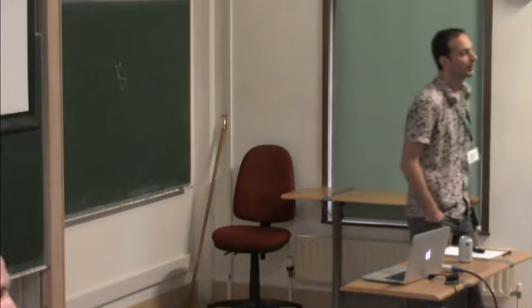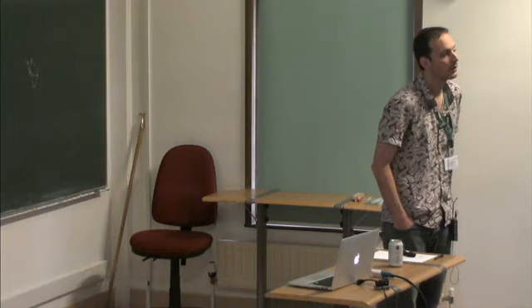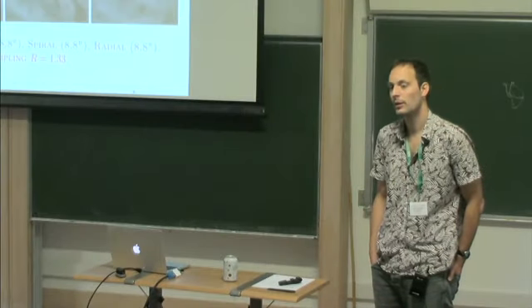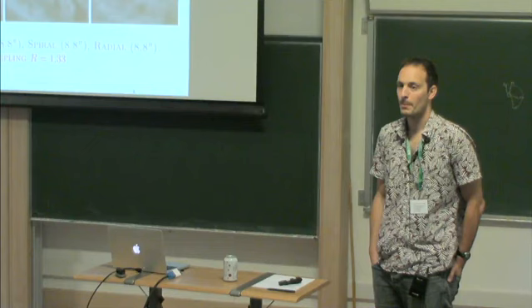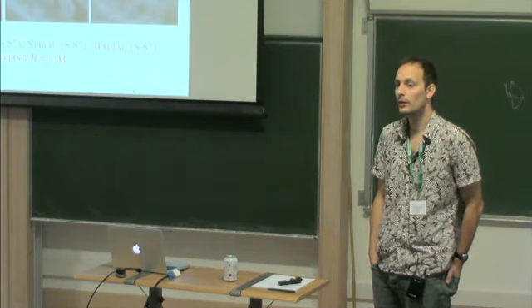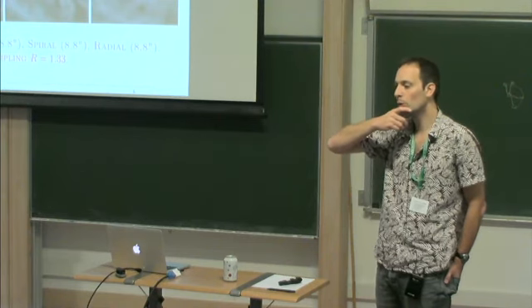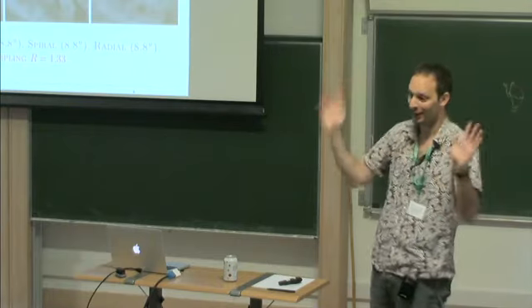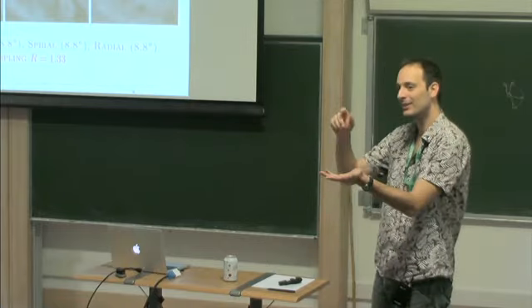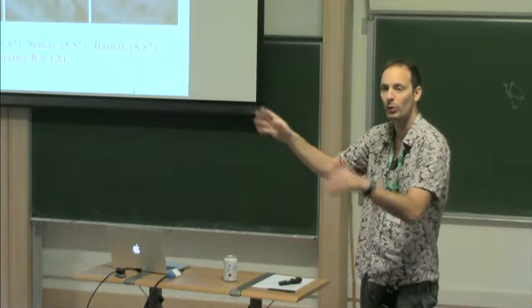Just a quick question about robustness, because you also mentioned it earlier. When you now have your trajectories and you program your gradient coils, they will obviously not do exactly what you want them to do. So yes, the trajectory will be slightly different. Did you actually check how, when you slightly perturb your trajectories, this affects the image quality? Yes, basically stable, for the reasons I have already mentioned. And now we have bought a new antenna, which is 300,000 euros. I don't have any money, but they bought that. And this is a machine that allows measuring the errors in the trajectory. So soon we will be able to say why it's working so well.